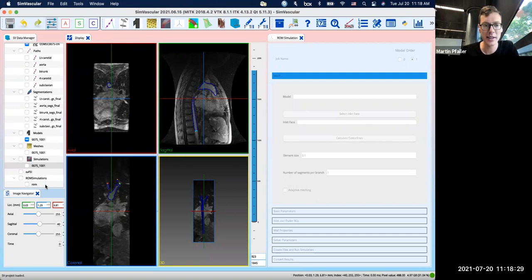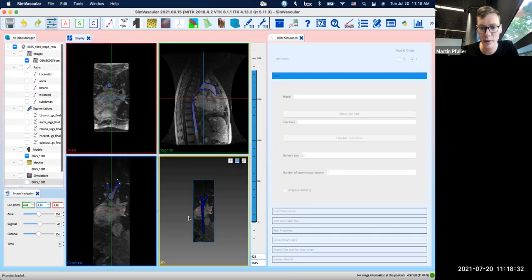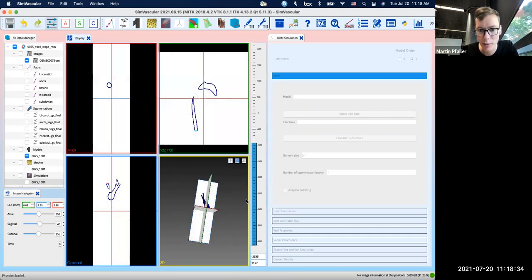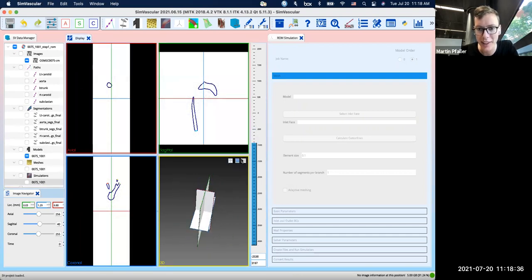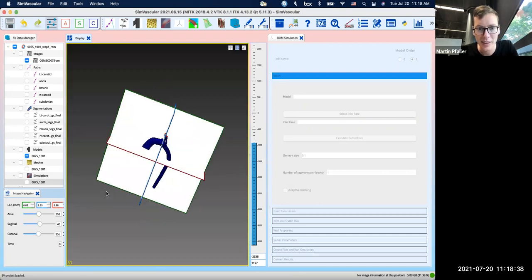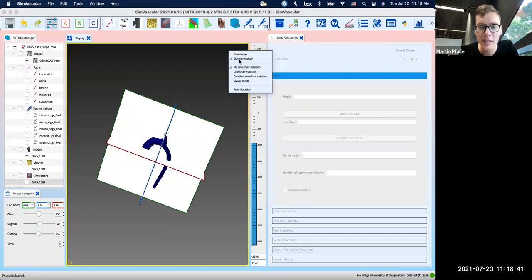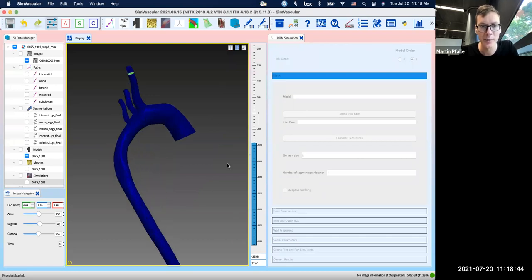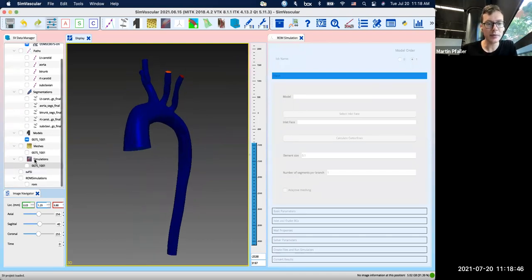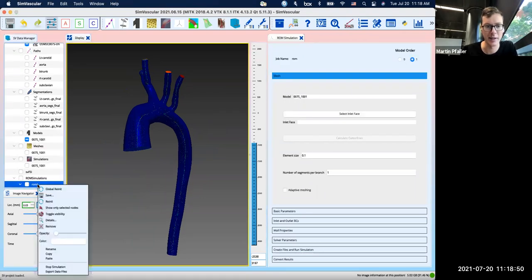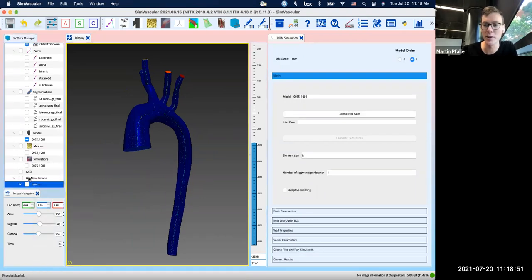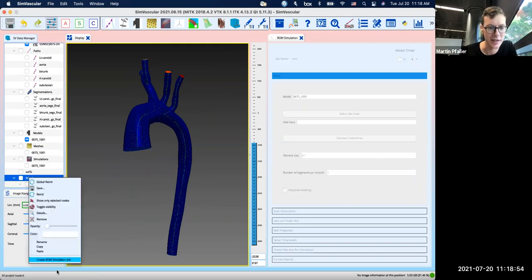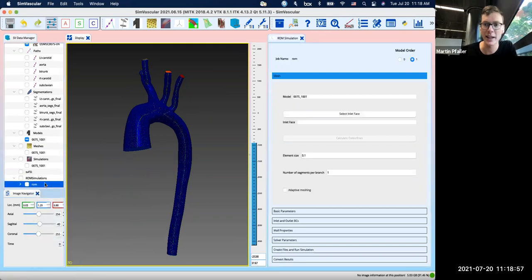So here I have a 3D model of the aorta. And then in this project I've already gone ahead and created that reduced order modeling plugin. So just by right-click here, create a ROM simulation job, I've created that.